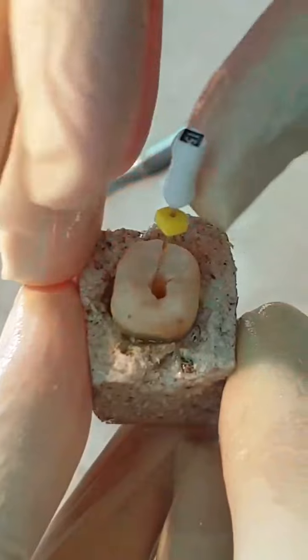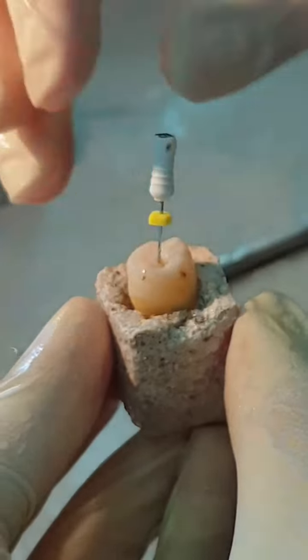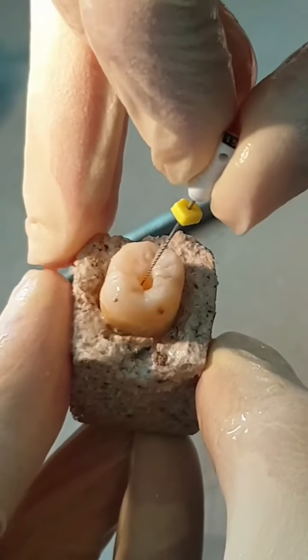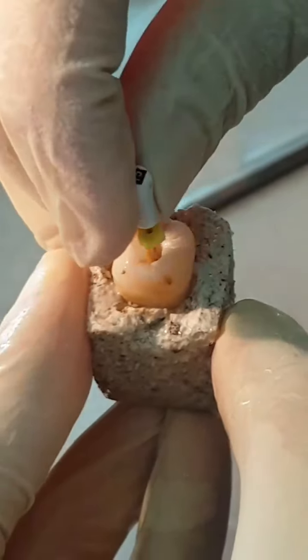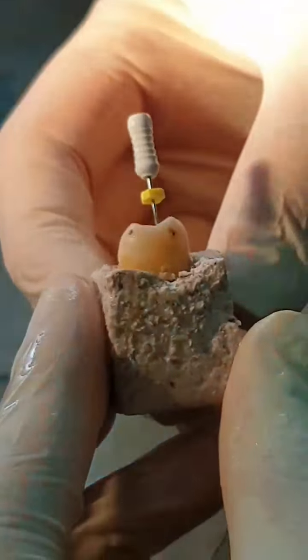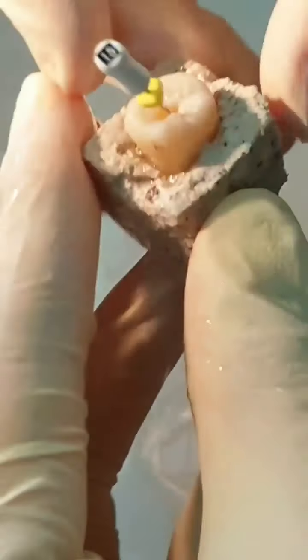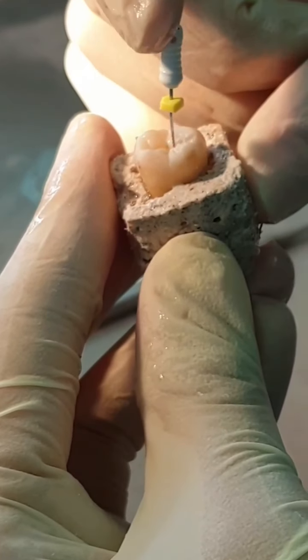Now we check all canals with file. In mesiobuccal canal, straight line access gets much better now, but we can have even more straight line access in mesiobuccal canal. Look, we have a sharp angle there too. In mesiolingual canal, it's good. We have a straight line access. About distal canal, we can have better straight line access too. So we are going to extend our cavity in mesiobuccal and distal areas.